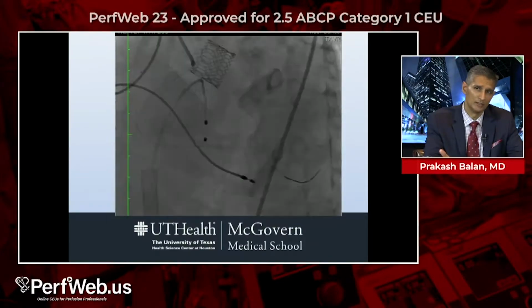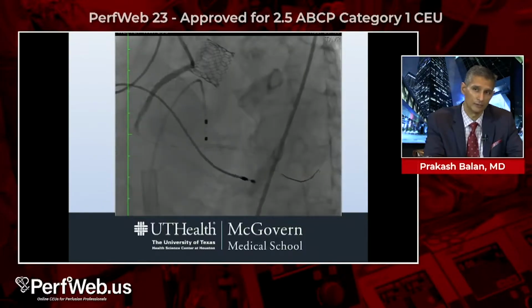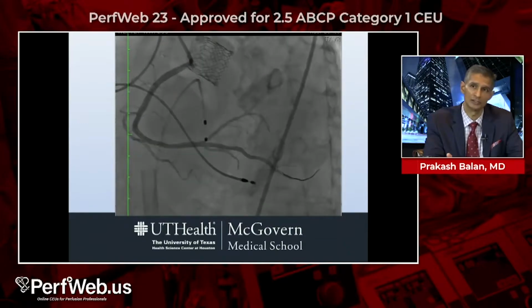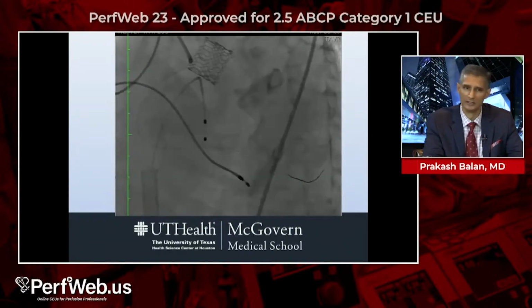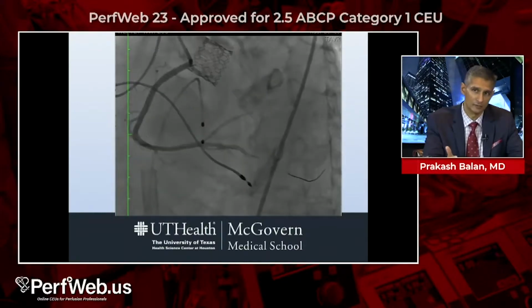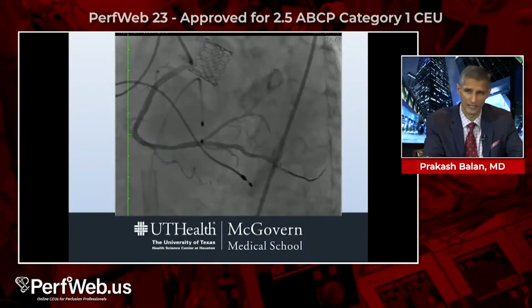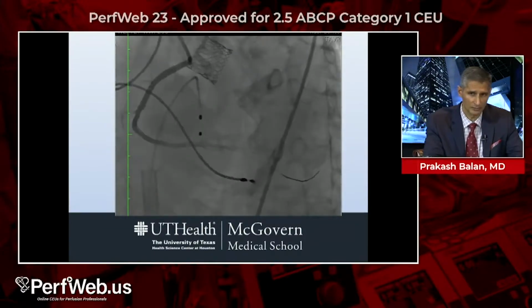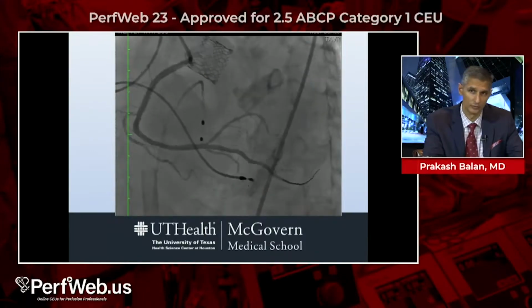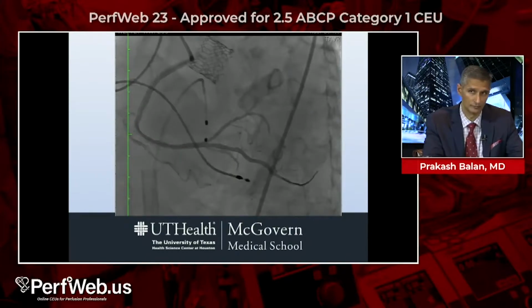Ultimately, here you see the final shot of the right. We were able to repair that. Excellent valvular function. We left her on VA support for 2 to 3 days as she recovered from the shock state. She came off VA ECMO 2.5 days after initiation, bridged out from there on a balloon pump, which is now out. The patient is now extubated off of all hemodynamic support, off of all pressors, is now doing physical therapy. Her EF is fully preserved.